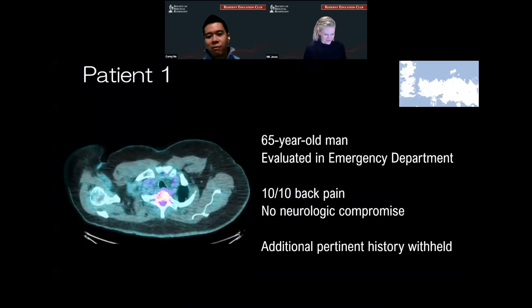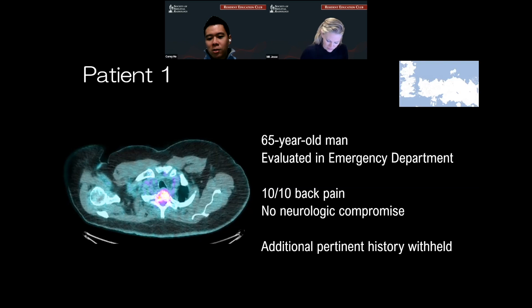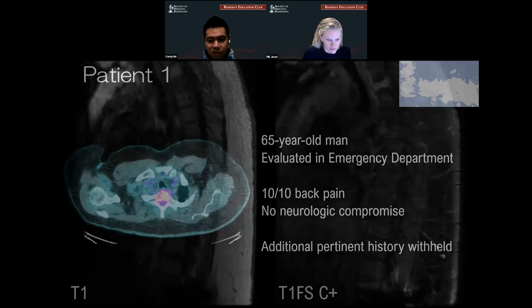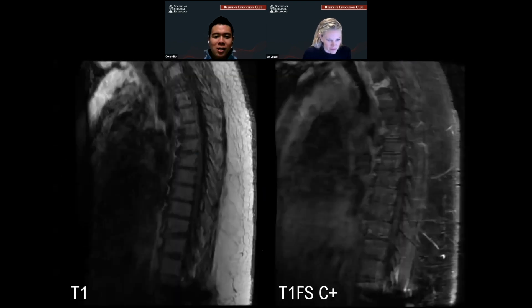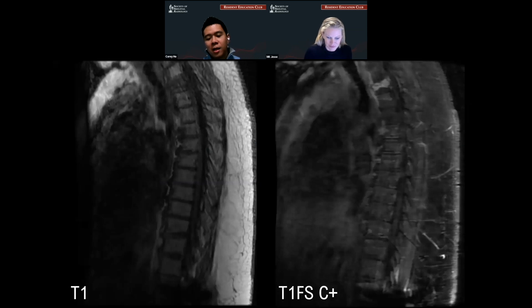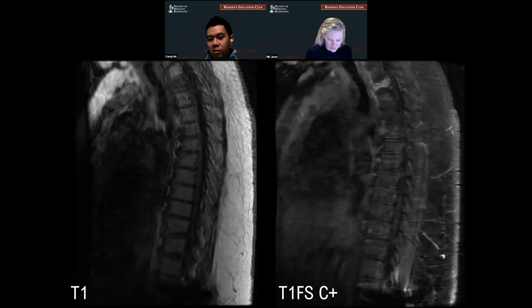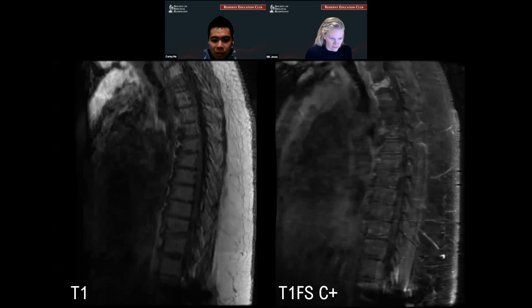Patient number one is a 65-year-old man that was evaluated in the emergency department, presenting with 10 out of 10 back pain. The patient did not have any neurologic compromise, and the additional pertinent history is withheld. This is our presenting imaging. The patient was in significant pain, so this is not the greatest imaging, but this is the real imaging that came through because the patient had to get this MRI. I'm going to highlight the findings here.